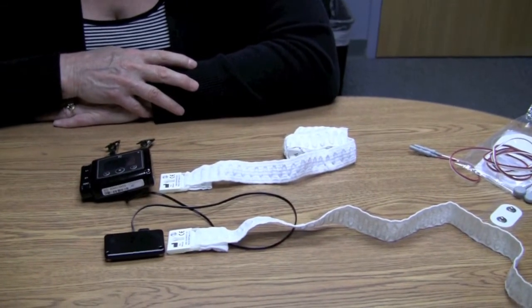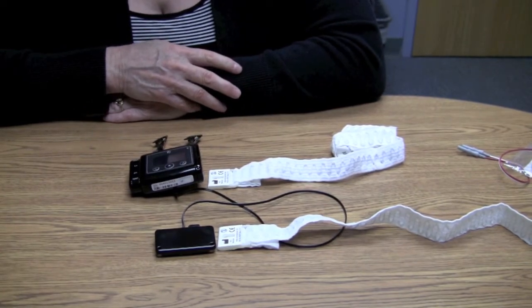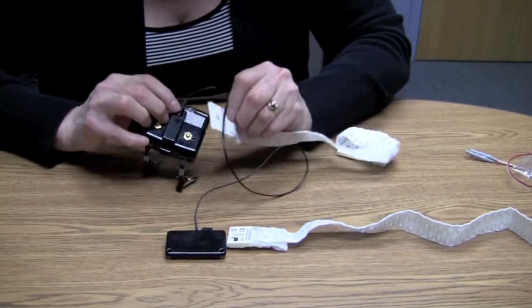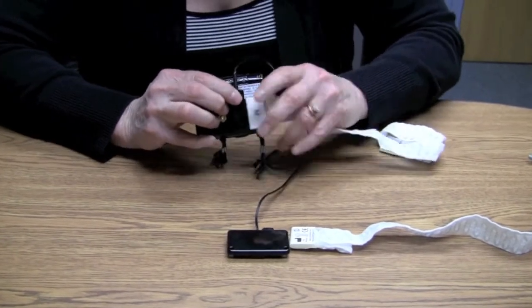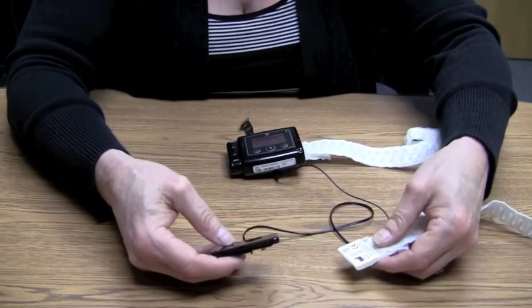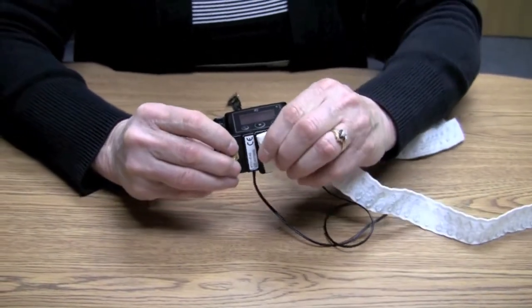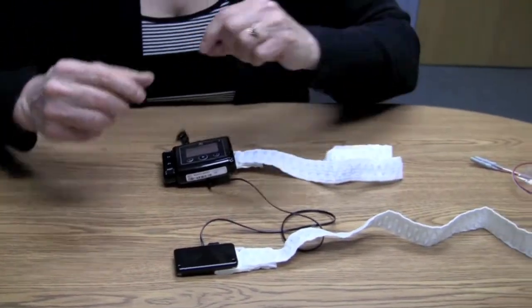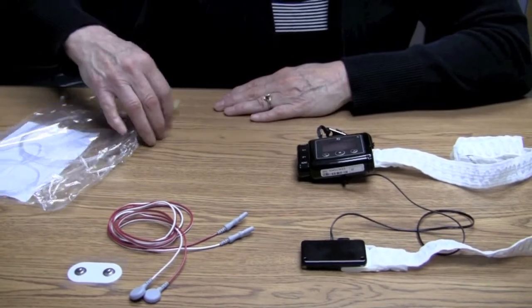Next, we're going to prepare one side of the belt onto the system so that when the patient arrives we only need to attach the second part of the belt. On the monitor you'll find a clip, and the clip on the belt — slide them together and attach them. For the part of the monitor that rests over the stomach area, do the same thing: clip them together and attach. We'll leave the second side of the belt open until the patient gets here.